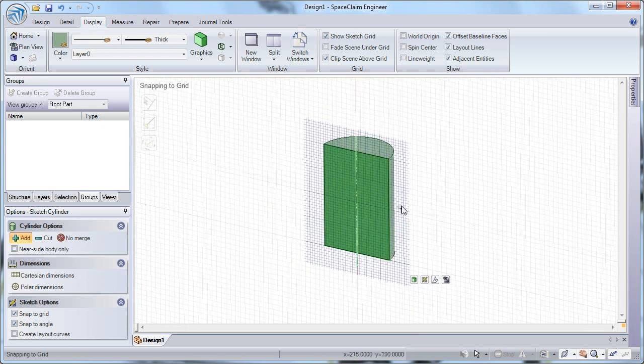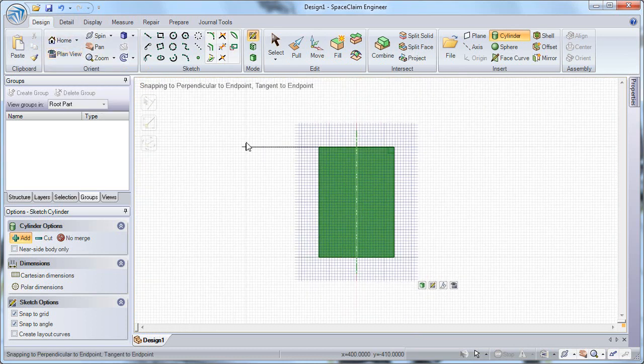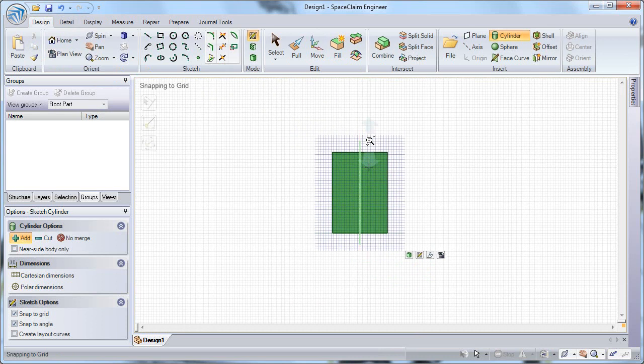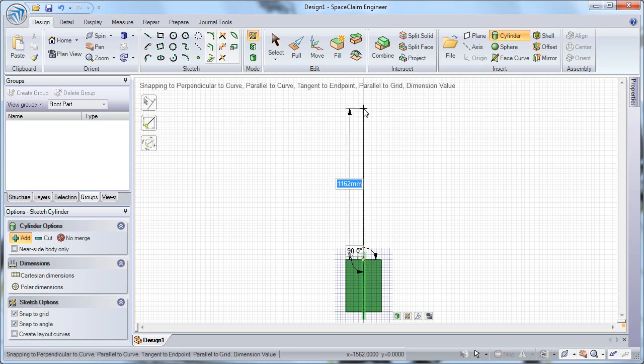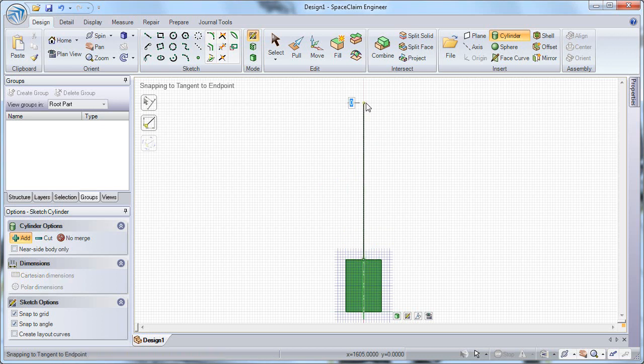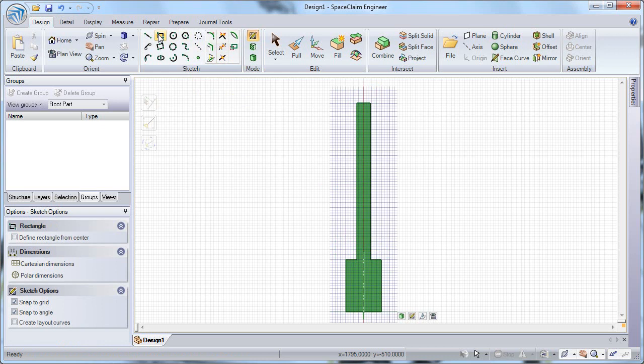So let's continue sketching with another cylinder, and we'll click Plan View in the Orient group to get a heads-up view of our geometry that we're creating. I'd like to snap to the midpoint on the top of the cylinder I just created, and I'm going to drag up 90 degrees and create a longer tower for the tower of this medical cart. And then again, choose the diameter and complete that. I'm going to select my rectangle tool in the sketch group on the ribbon, and now I'm going to sketch a quick rectangle for the base at the bottom of this part.